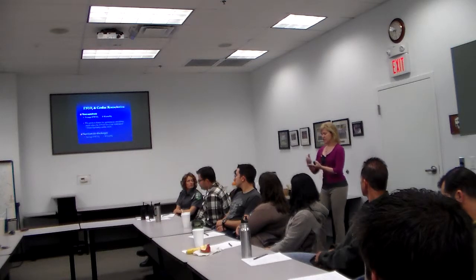Because the other thing on this, I looked at the PCR, he documented all of his end-tidal CO2 numbers. The O2 sats were in the 70s the whole time. Well, he's not oxygenating anymore. This guy's been down now for probably 25 minutes, but he's got some CO2 left, so we've got numbers that are reflecting that. It's 10, it's 9, but you know your tube's in. And that's what it was all about at this point.